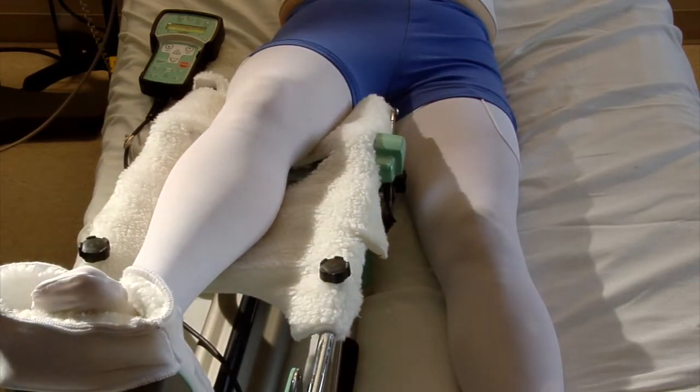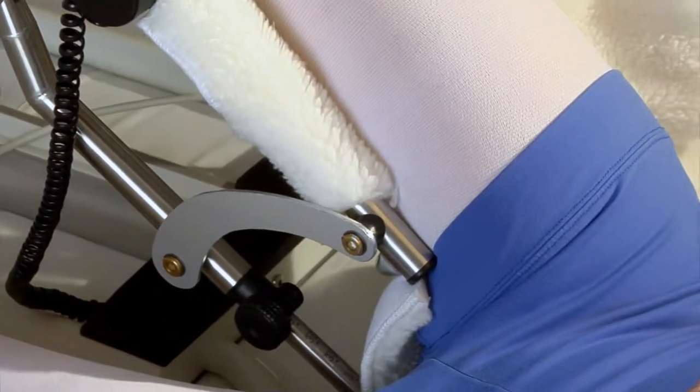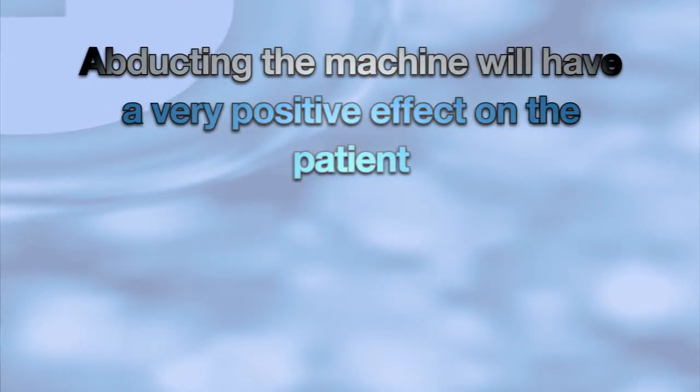Please realize that most people don't sleep with their legs perfectly straight down the bed. Most of us sleep with our legs slightly apart so that our feet are about shoulders width apart. Abducting the CPM will also help to reduce patient complaints about the machine touching sensitive areas in the inner thigh. I cannot stress enough the positive effect that abducting the machine will have on your patient.